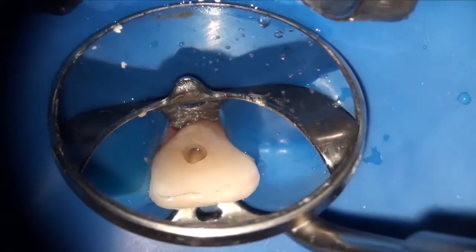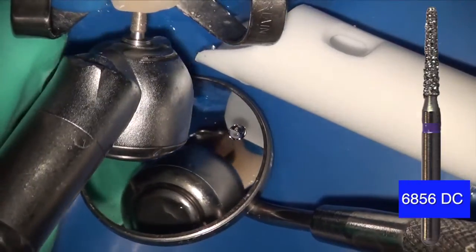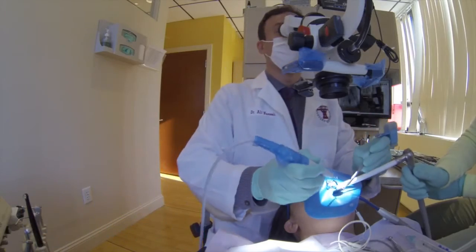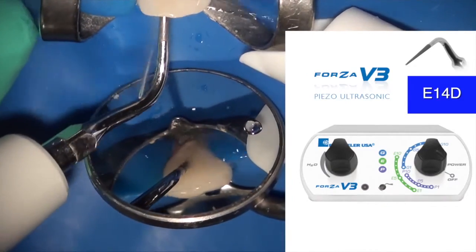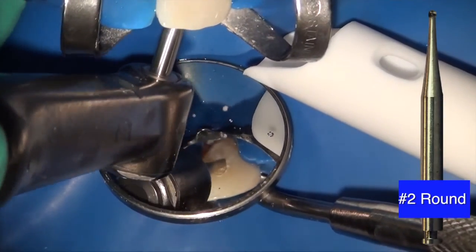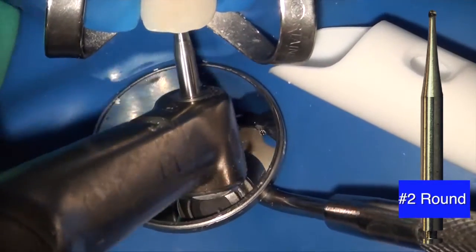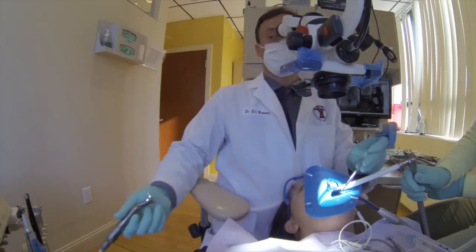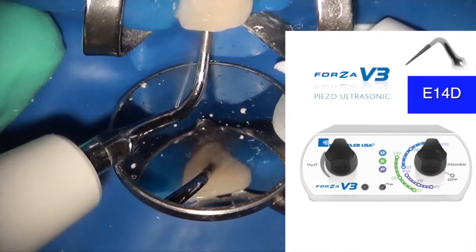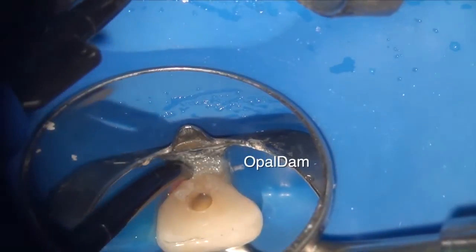Every time I use a handpiece and generate some cut debris, I move to use the ultrasonic to remove the debris efficiently. Now I'm using the 6856 DuraCut, which is also in the Access Kit, just to make everything flow like a diamond, and I immediately follow that up with the Forza V3 with my E14D tip. Now I'm using the surgical length round burrs, which allows removal of the triangle of dentin around the CEJ in a more controlled manner. After cutting dry with the slow-speed burr, I use the ultrasonic to clean up.